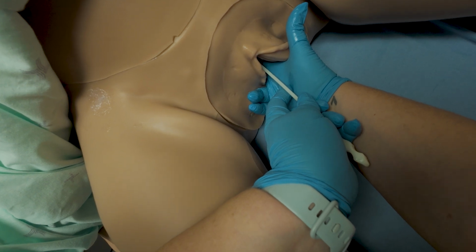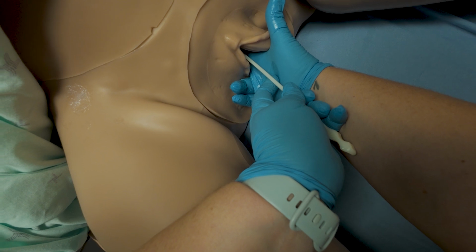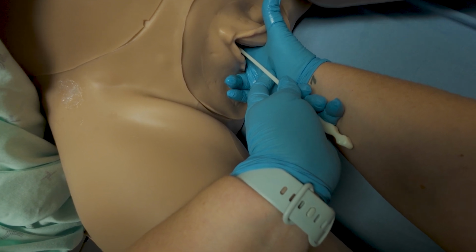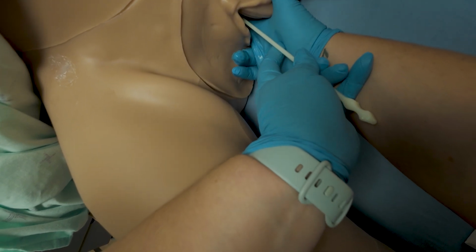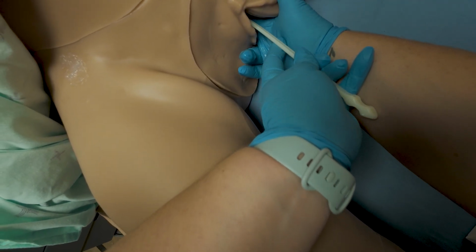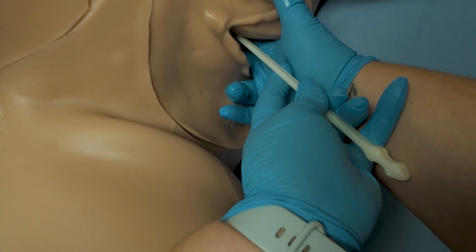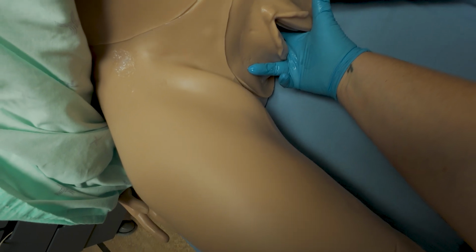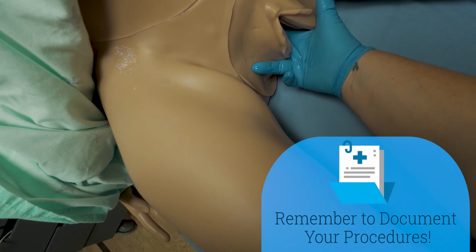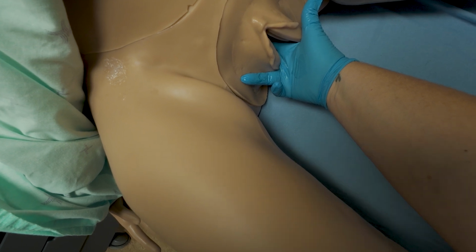Now I can feel with my index finger where the amni hook is touching the membrane. I'm using the tip of the amni hook on the membrane and rotating it slightly to tear the membrane in a motion just like this. Do it one more time. And now we remove the amni hook. We can see lots of clear fluid. We're going to note the color of the fluid, the amount of the fluid, if it has any odor, and if there's blood in it or meconium.